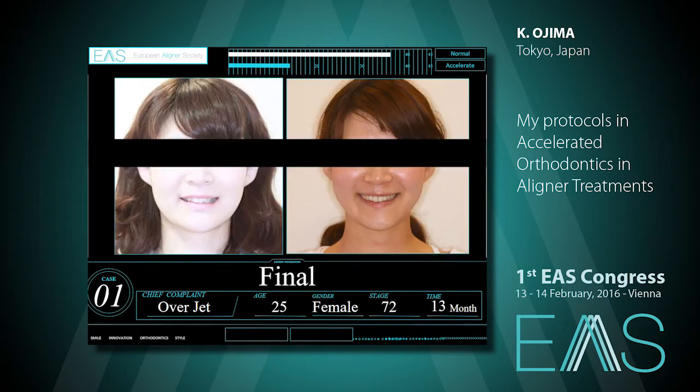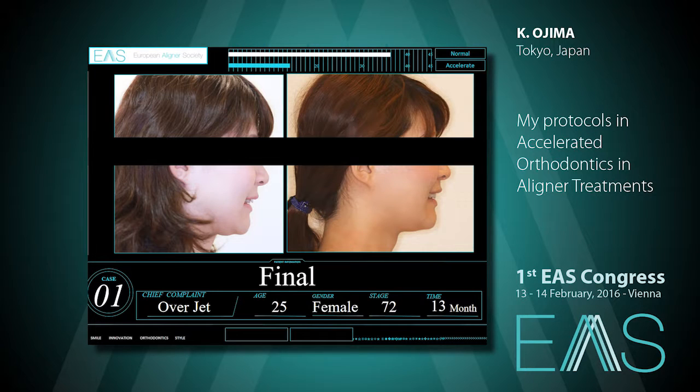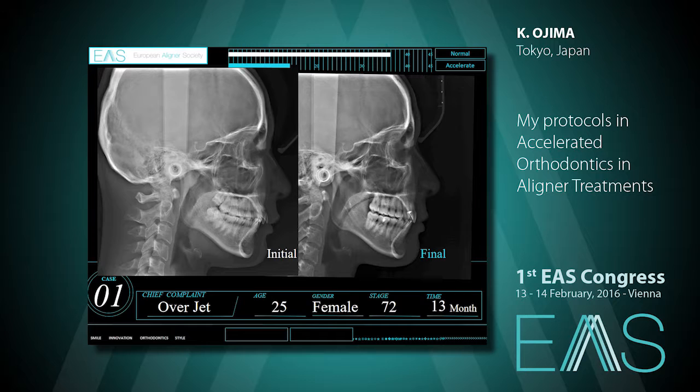This is the final ClinCheck. Initial and final. The superimposition. As you can see, molar bodily movement was achieved, along with the retraction for the severe overjet.